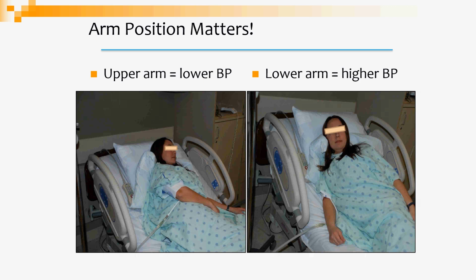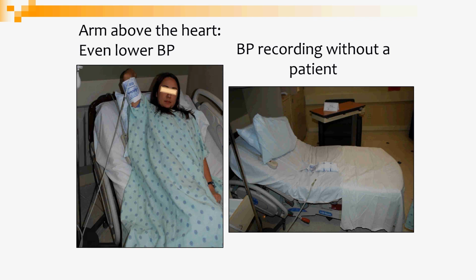And again, if the patient is lying on one side or the other, and you have to switch arms, you document that you switched arms so that we can see whether there's any variance, or those staff that are following can see whether there's any variance in the blood pressure. Next slide. Again, we'll keep talking about why position is important.